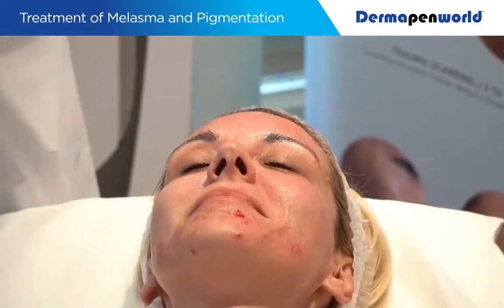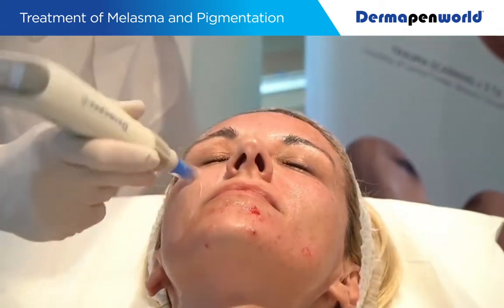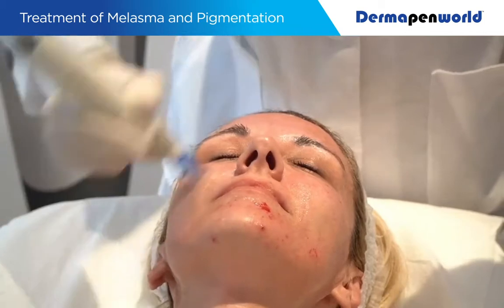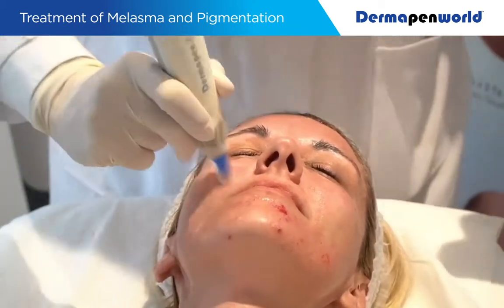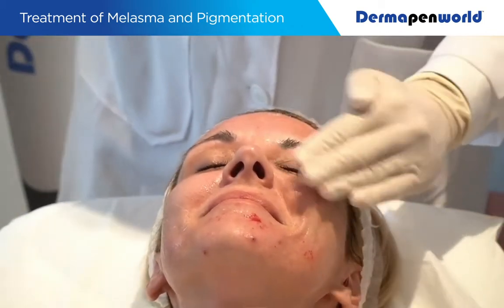The occasional pinpoint blood on the cheeks. Perfect. Vertical. Horizontal. Diagonal 1. Diagonal 2. Perfect. Around the eyes, I just reduced that to 0.3.